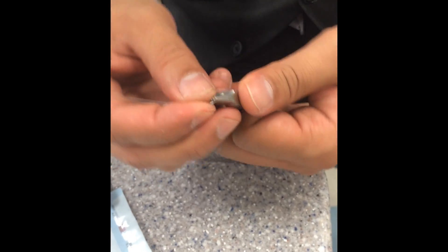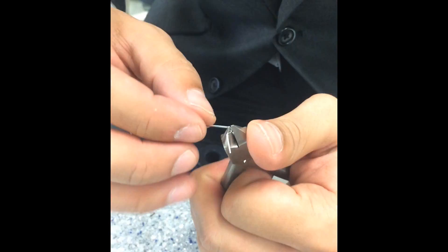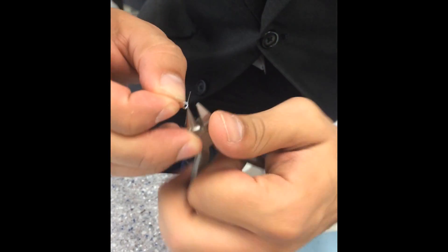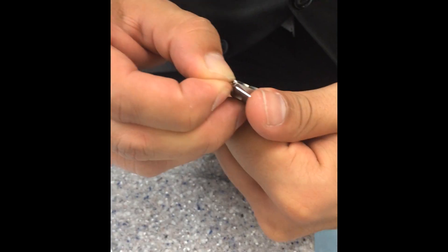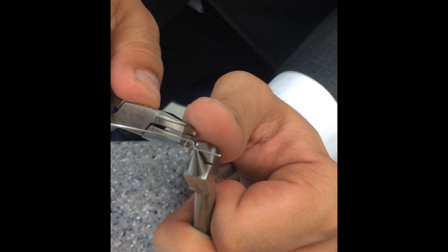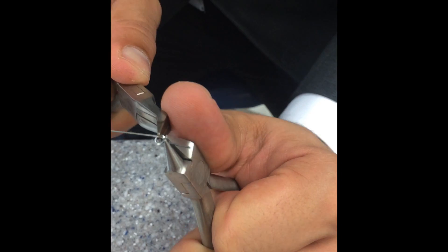So you do a bend like this. We're going to roll it out. Because I know this patient needs a little torquing out, I'm going to twist a little like this because we already know.